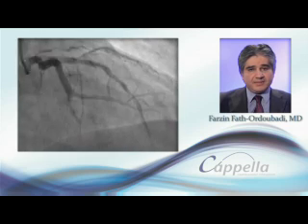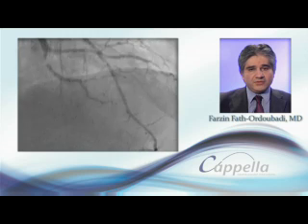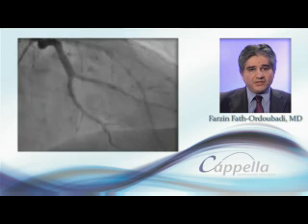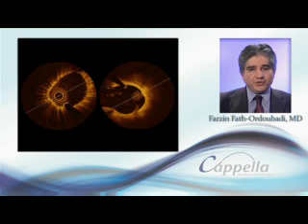Here is an example of a side branch lesion in an AV sec close to a large OM vessel. SideGuard was only deployed in the AV sec. The OCT pictures show good apposition of the stent within the lesion and full coverage of the ostium without disturbing the healthy adjacent large OM vessel.